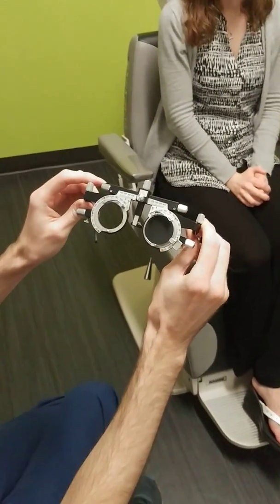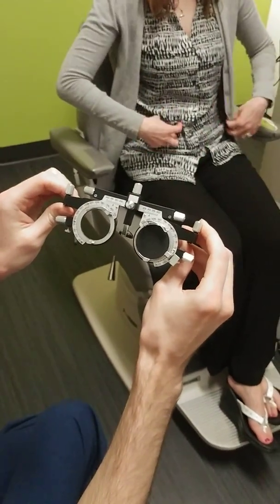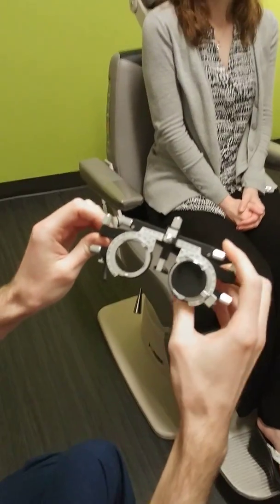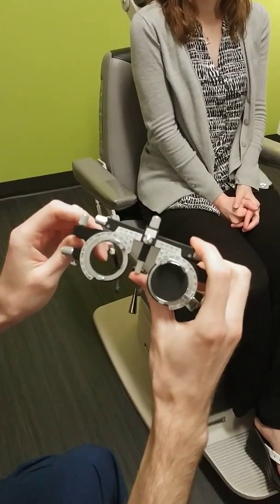Hello, this is Dr. Kinnick talking to you about trial frame refraction. Before we get started with actually refracting someone, we're going to talk about the different adjustments that are actually on your trial frame.